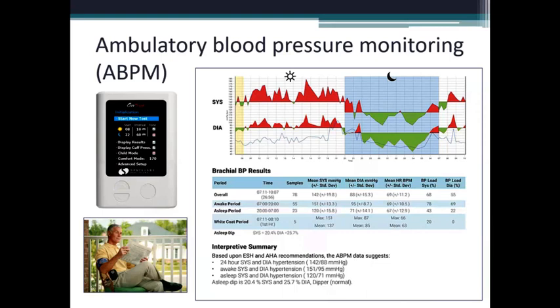well. Now, there are some exceptions to that, particularly individuals with particularly severe hypertension where the inflation pressure on the cuff has to repeatedly go quite high. Some people can find it uncomfortable and can even get bruising around the arm over the 24-hour period. I used to be concerned people would wake up all the time at night with this, but in general, that hasn't been a major complaint that I've found. People generally sleep after the first time it goes off at night.